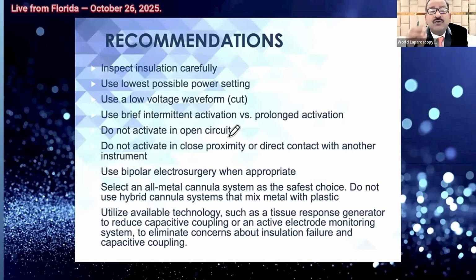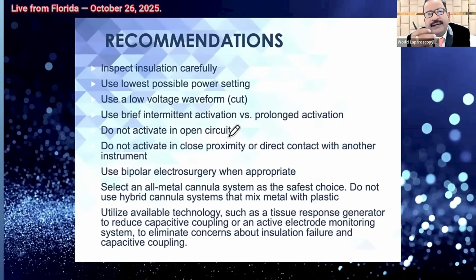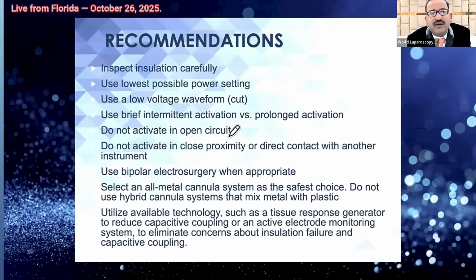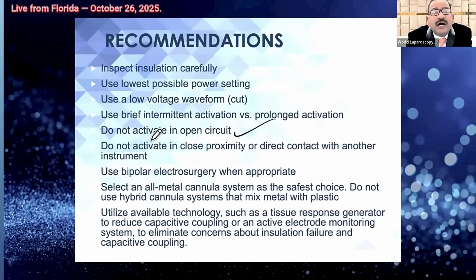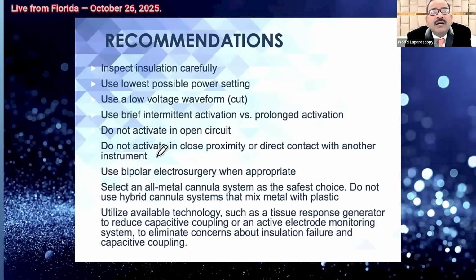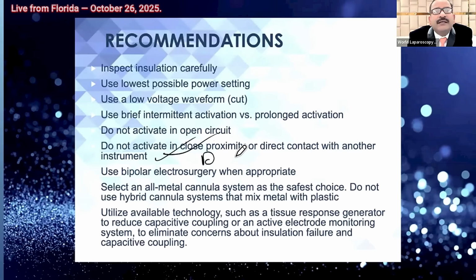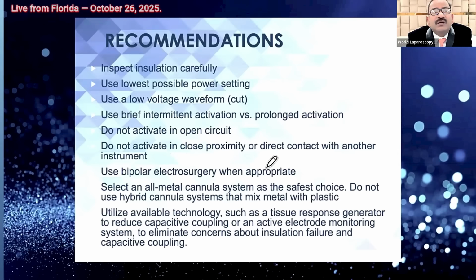Third, when you want to cut, stretch; when you want to coagulate, relax. And fourth, which paddle you should press: for cutting, press yellow; for coagulation, blue. So always hook, look and cook. Without hooking, do not activate, otherwise it will burn. Do not activate in close proximity to prevent what? Direct coupling. Because direct coupling will happen if you are very near the other instrument.